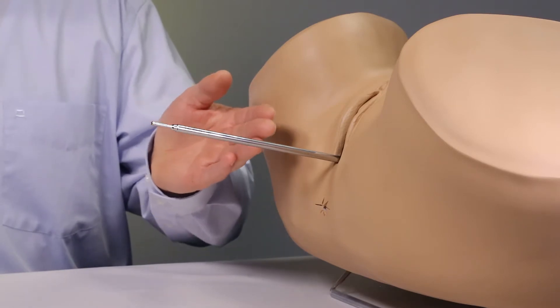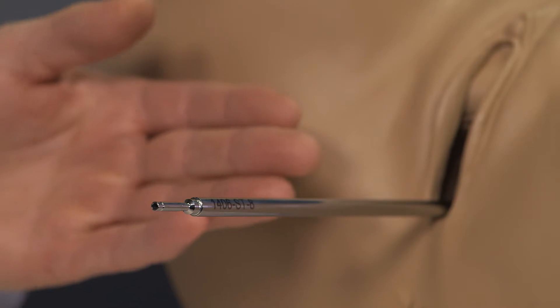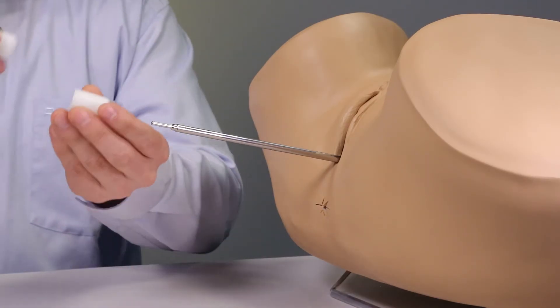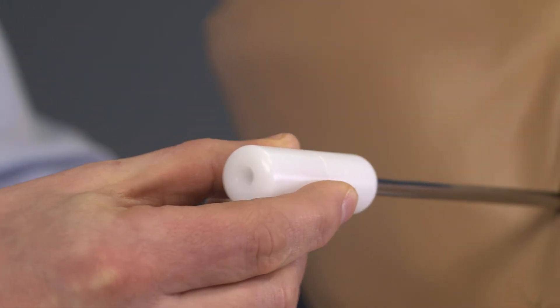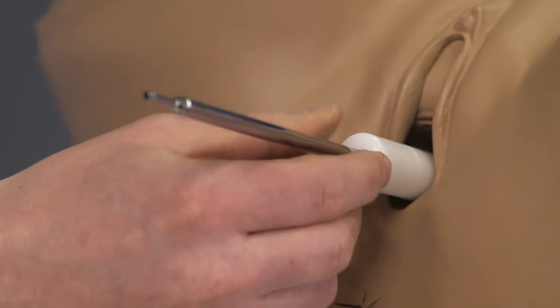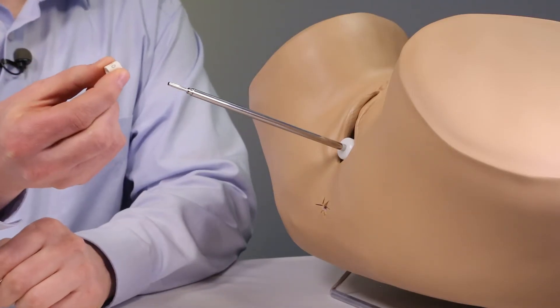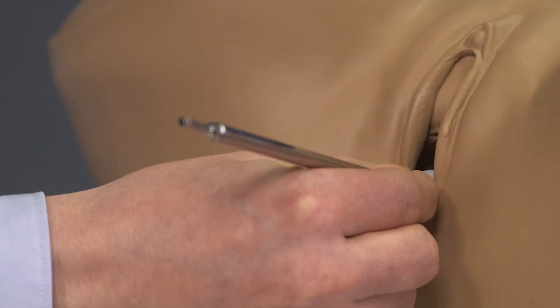We can assume the intra-uterine tube with the integrated cervical stop is already implanted. In this case, the distal and proximal cylinder segments are sufficient. They are guided over the intra-uterine tube until they reach the cervix. A spacer of one centimeter is sufficient to allow enough spacing for the perineal bar.